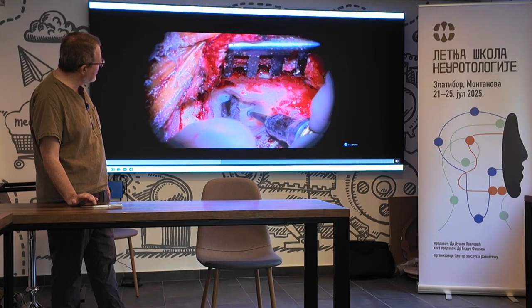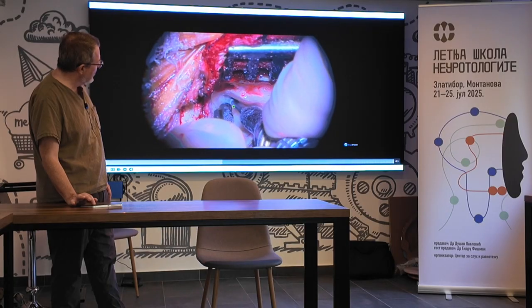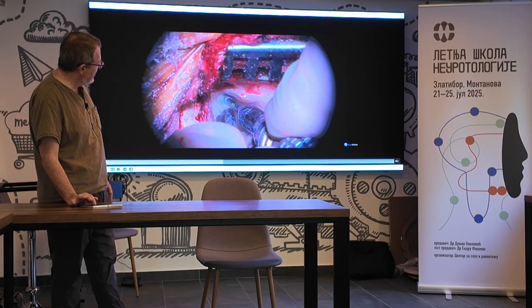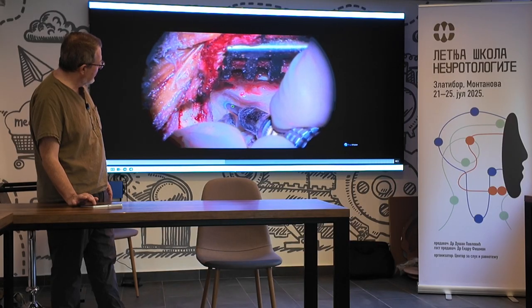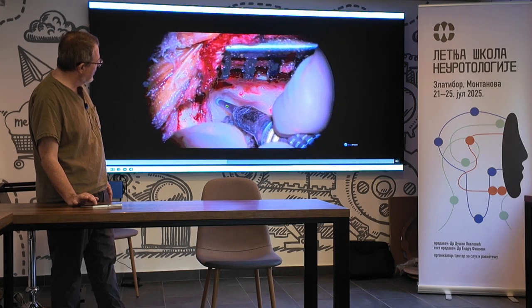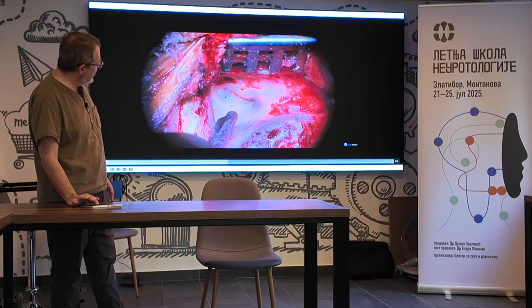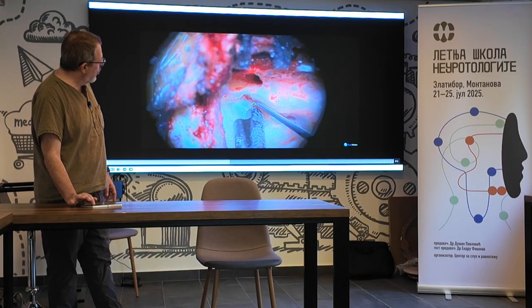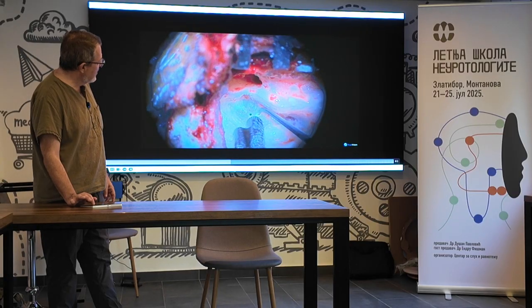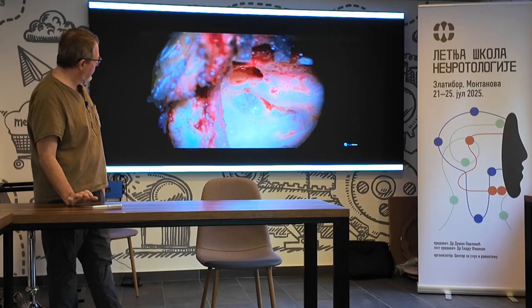This is the very distal end. And that little dot you see here, that's the singular nerve. You're going to see it under here when I take the drill away. See, there it is. That little dot right there is the singular nerve. It's a separate channel coming off of the inferior vestibular nerve, right there, that little circle. So they're very close to one another, and I just have to open this lateral end of the internal auditory canal and gently section these nerves.